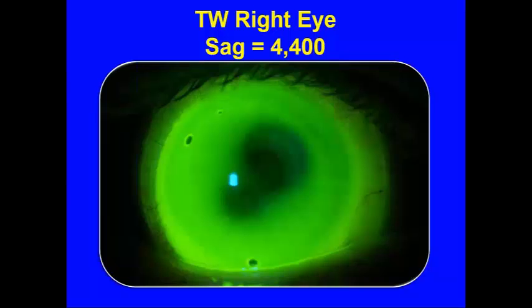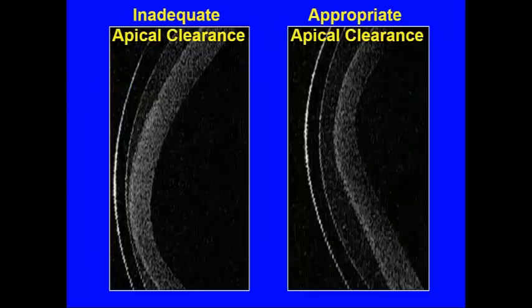Now, the rest of the lens actually looks quite good. You can see the limbal clearance. You can see the lens clearing quite nicely in the peripheral cornea. We just need more depth to the contact lens. Now remember, we're going to have to raise this lens up to not only eliminate the fluorescein thinning in the center, but we also need about 300 microns of additional clearance to account for the settling effect of the lens.